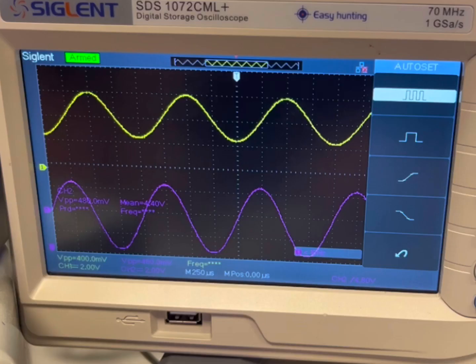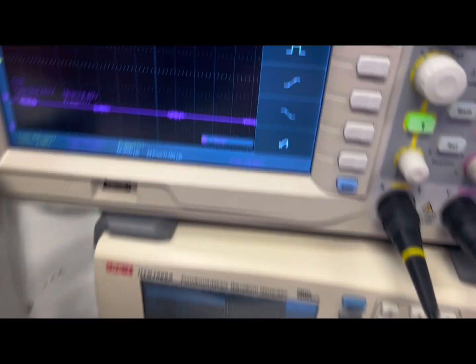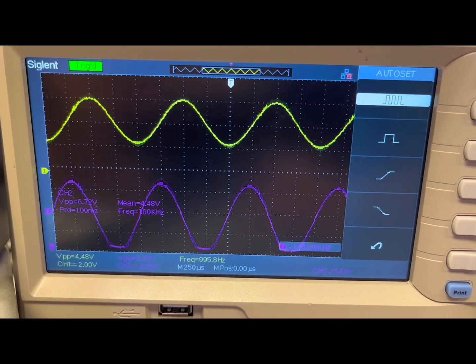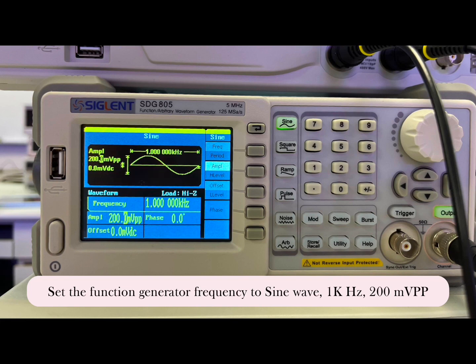To set up stage 3, we will place the oscilloscope probes in both TP3 and TP4 and leave the power supply and function generator untouched. There, we can get a filtered output voltage of 4.4 volts. The output waveform at TP4 will be determined by the output waveform at TP3. So, by turning the trimmer in stage 2, we can see how the output waveform is being affected. As mentioned earlier, when frequency is below 500 Hz, the amplifier will be at unity gain. However, in this case, unity gain is not applicable as frequency is set at 1000 Hz. Hence, there is an output voltage drop from TP3 to TP4.